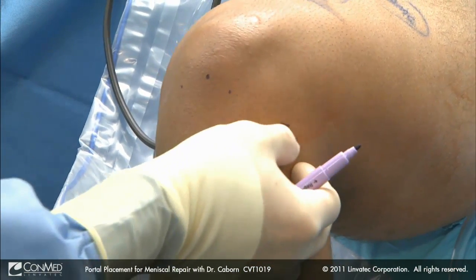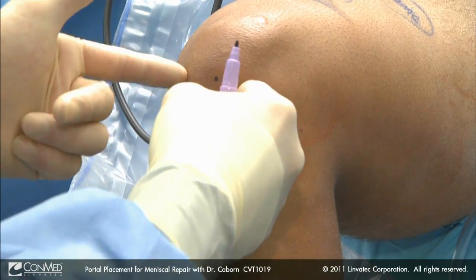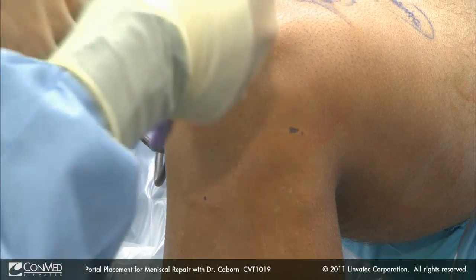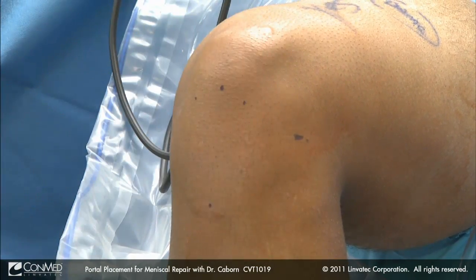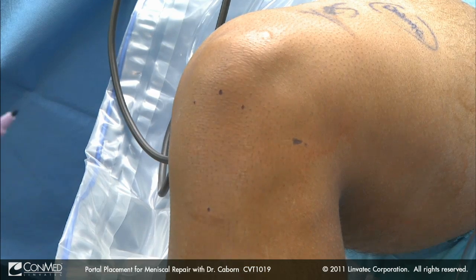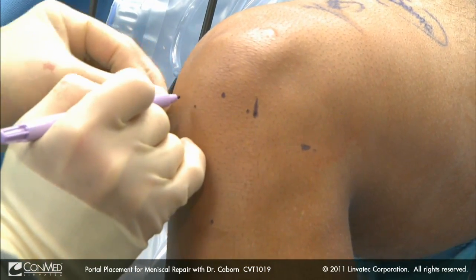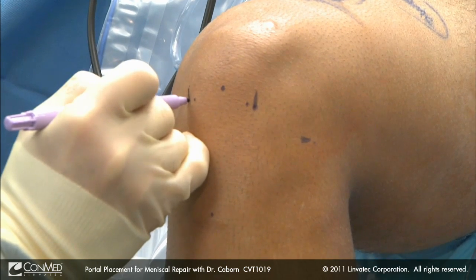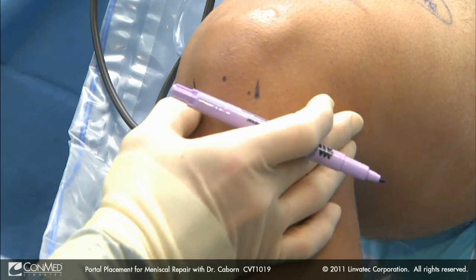In addition, we like to pay attention to the slope of the tibia to make sure we're high enough with these portals to get good accessibility — adjusting to the slope of the tibia and to access the posterior portion of the meniscus. That's why we advocate using a vertical arthroscopic portal and not a horizontal portal, because it somewhat limits your accessibility to that posterior aspect of the meniscus.